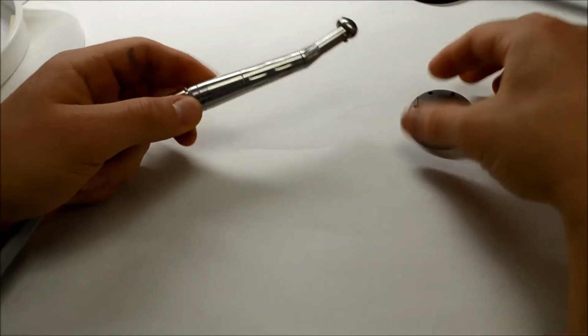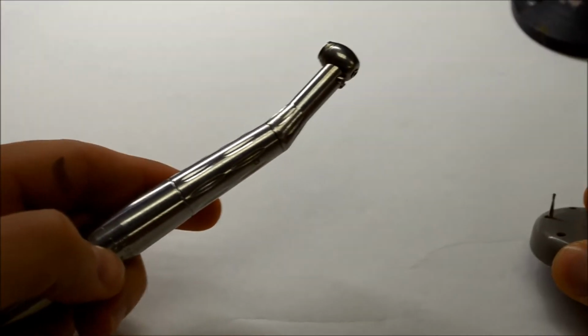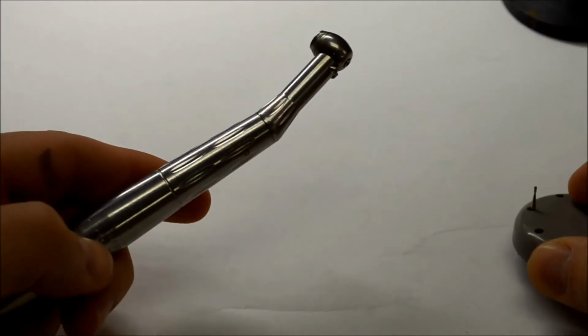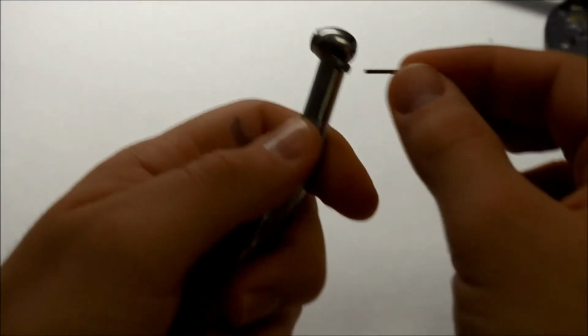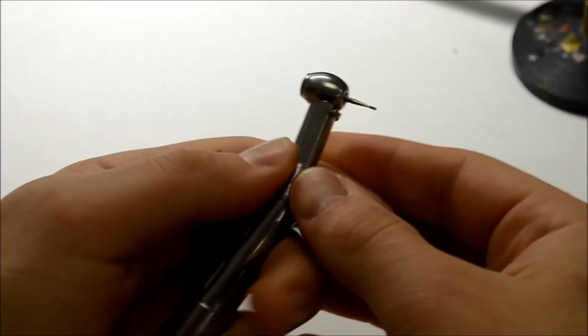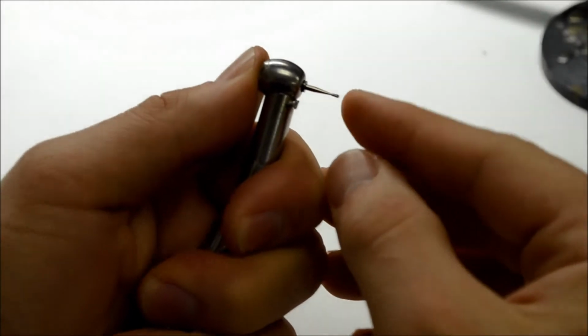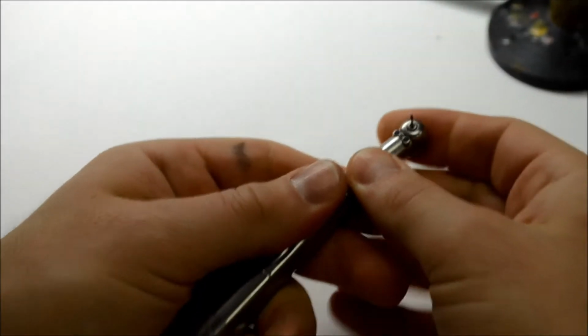The second important part is the burr. The burr is part of a burr block in our kit. There's a lot of different types. This one's called a 330 burr. To put it in, you just stick it in the hole, and then there's a button on the back of the head. You press it pretty hard, and then you push the burr in, and it stays in pretty tight.